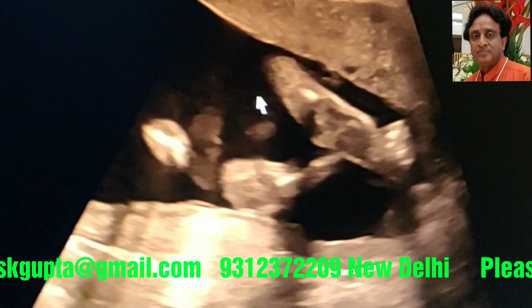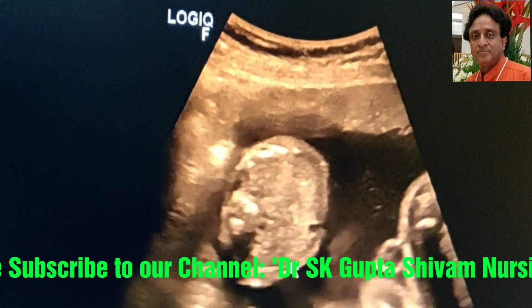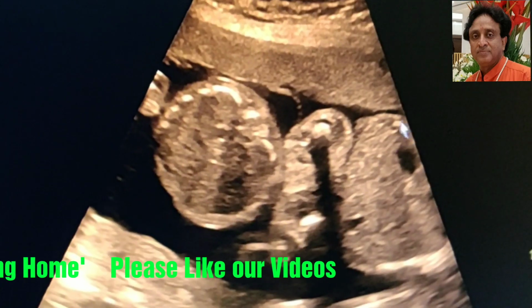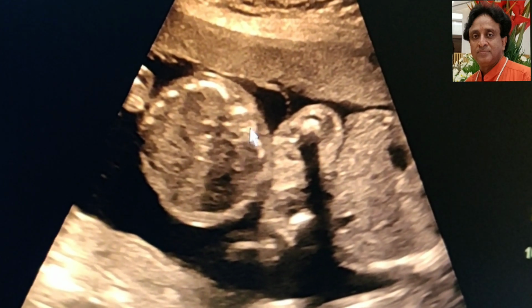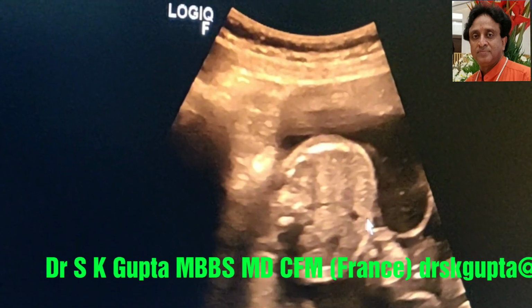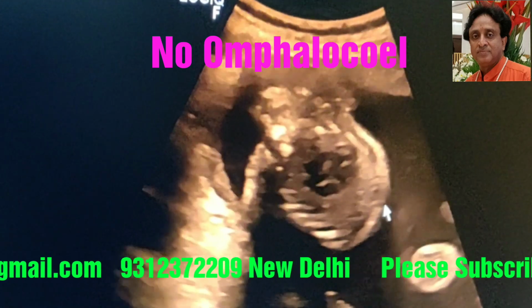this view. And the fetal abdomen is slightly smaller in twin 2. There is no evidence of twin to twin transfusion syndrome, though there is evidence of slight IUGR in the anencephalic twin. This is one fetus with a large abdomen, and this is a small fetus, which is the anencephalic fetus, in the intertwin membrane and single placenta. And there is no omphalocele, because these twins which are anencephalic may have encephalocele, cardiac defects.